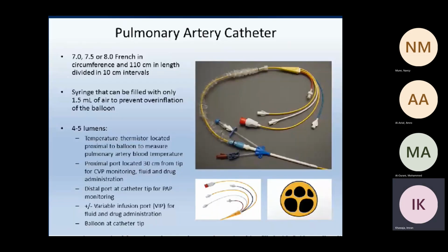Okay, you are familiar with the catheter, and there are two used catheters here. You can pass them around when we finish, and if you have questions, I can go over this. But as far as the structure of the catheter, it is different from the CVP catheter lengthwise, because of the distance it has to traverse, typically 110 centimeters. And then you have black stripes that indicate the distance. Each is 10 centimeters, and there is a wide stripe that would be 50 centimeters. So that's on the catheter itself.